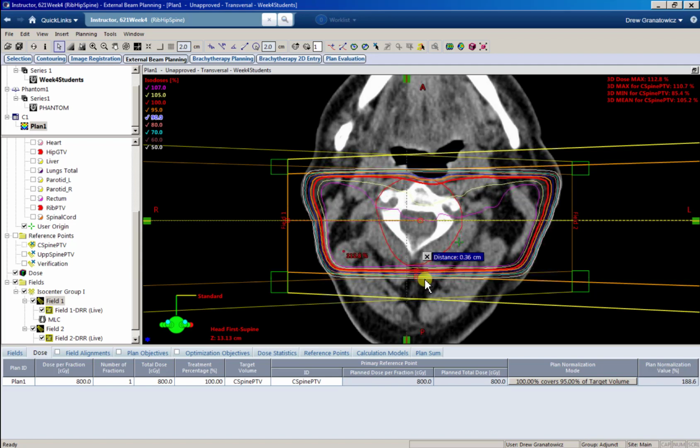So what can happen is, with that same block margin, we only have a half cm block margin, right? So if that penumbra region gets too big with that higher energy, we'll lose coverage laterally, around the edges of our PTV. And because we lost that coverage, in order to get the same amount of coverage, you actually go up. So it's a balance between superficial coverage and deep coverage and your penumbra and all that. A lot of times I just calculate both and see which one's going to work out best.